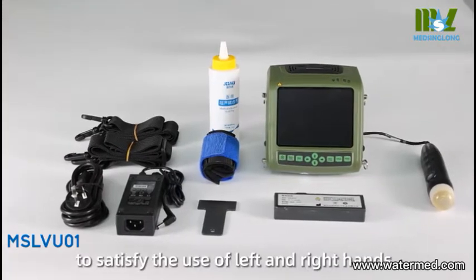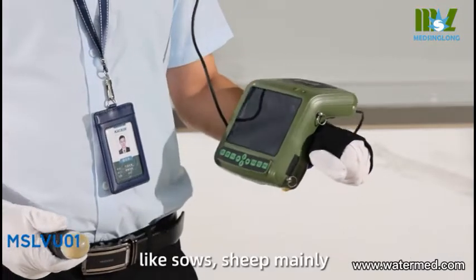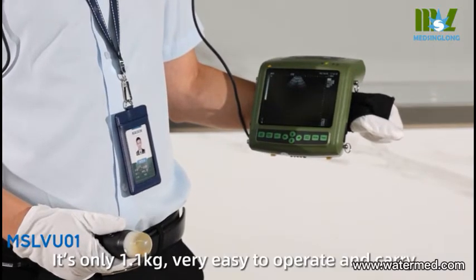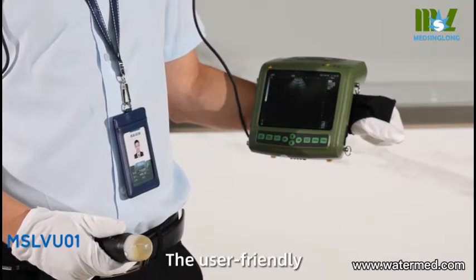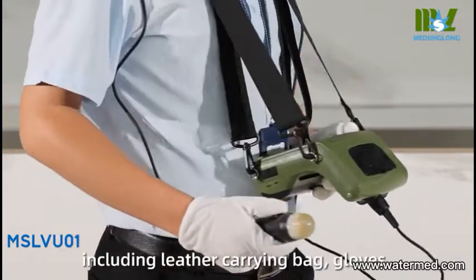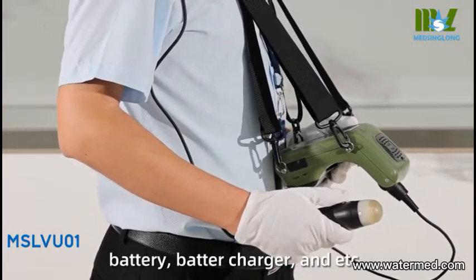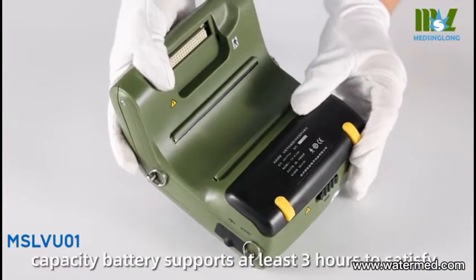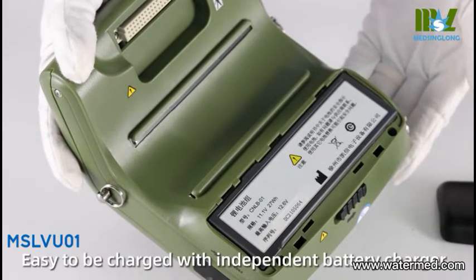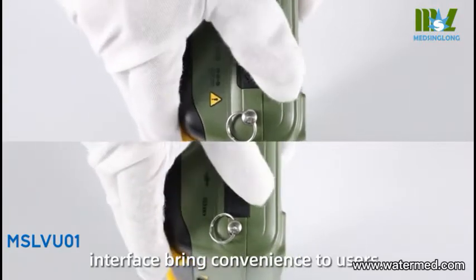Designed to satisfy the use of left and right hands, this device is used for fast pregnancy detection of livestock animals like sows and sheep. It weighs only 1.1 kilogram, making it very easy to operate and carry. The standard configuration includes a leather carrying bag, gloves, battery, and battery charger. The large capacity battery supports at least three hours to satisfy daily workload requirements, and it is easy to charge with an independent battery charger. The multi-function interface brings added convenience to users.